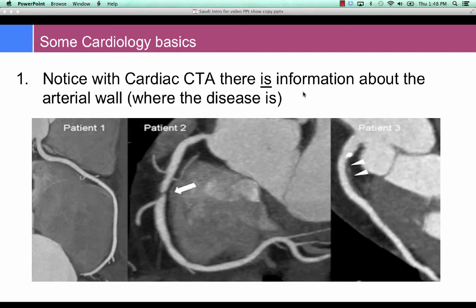In other words, when studies are done trying to look forward and say, is there a way by CT to characterize plaques which may not be obstructive but might be clinically important? We can look for this sort of information with CTA and recognize the abnormalities in the wall of the vessel that do accompany the potential risk of what could be a culprit plaque at a later time. Patients like this wouldn't necessarily, by current practice standards, go on to have an interventional procedure performed, particularly if it could not be shown to limit flow.